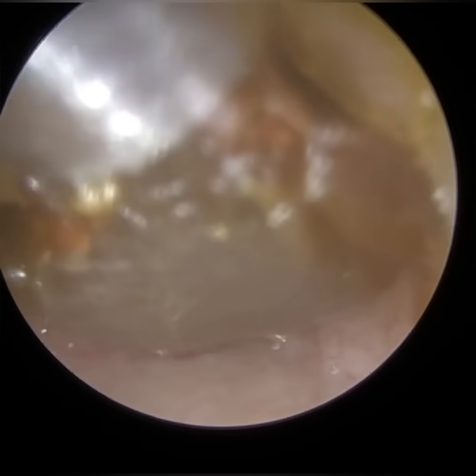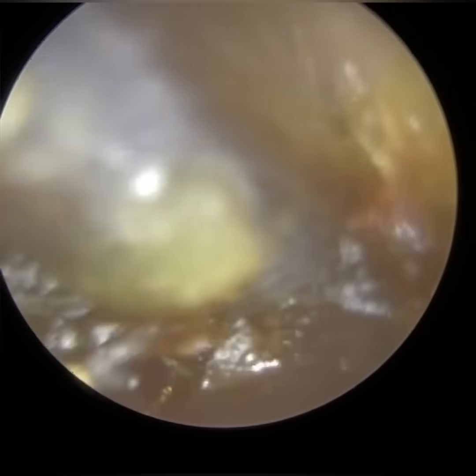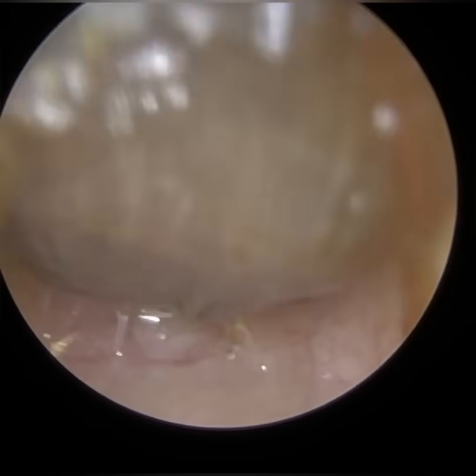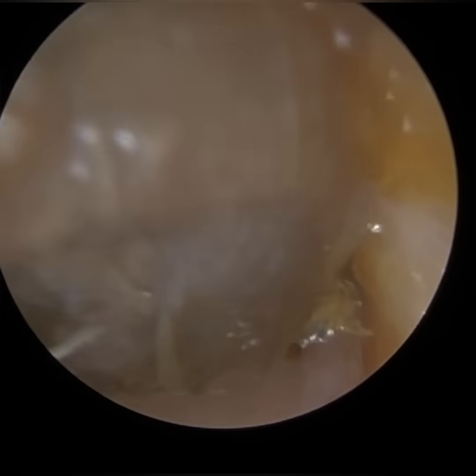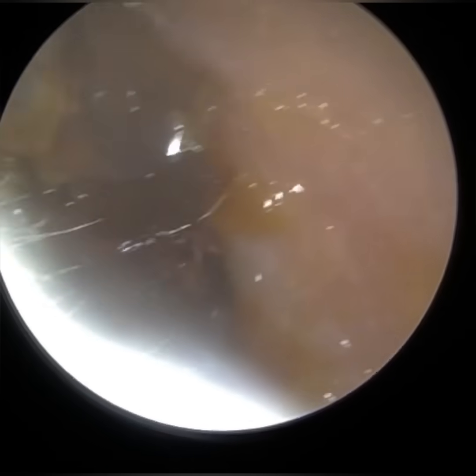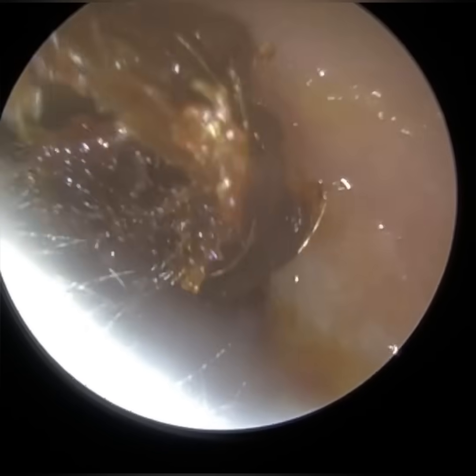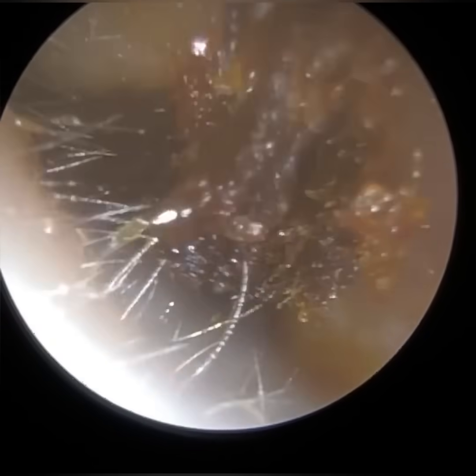Then you've got a short process of the anvil, which you don't normally see, and then you've got the long process. The long process of the anvil you can typically see in younger patients where the eardrum is still translucent. As we get older, the eardrum loses its translucency and becomes more opaque, making it more difficult to see. Also, if the eardrum is retracted — sucked inwards — you can sometimes see the long process of the incus.